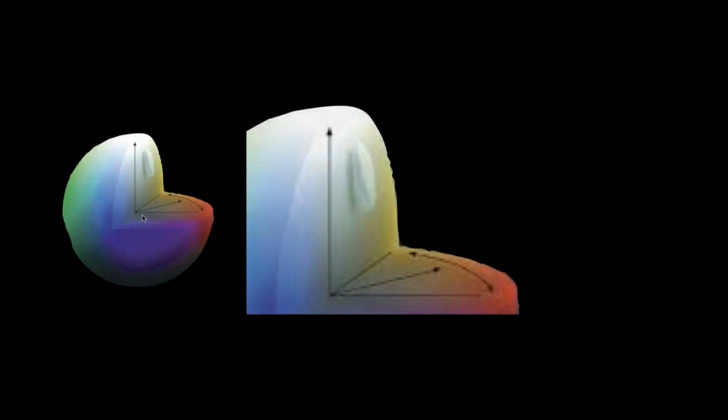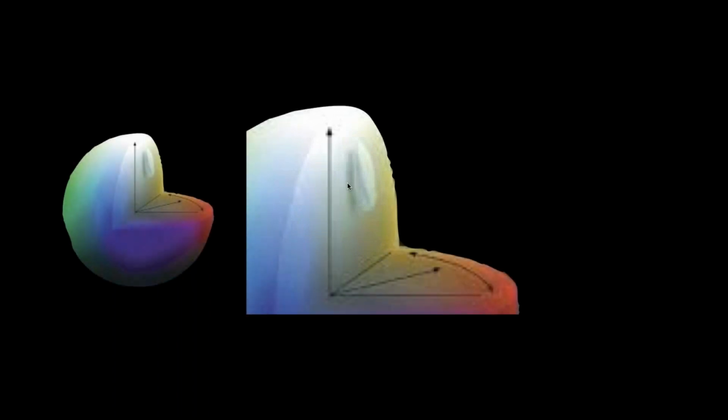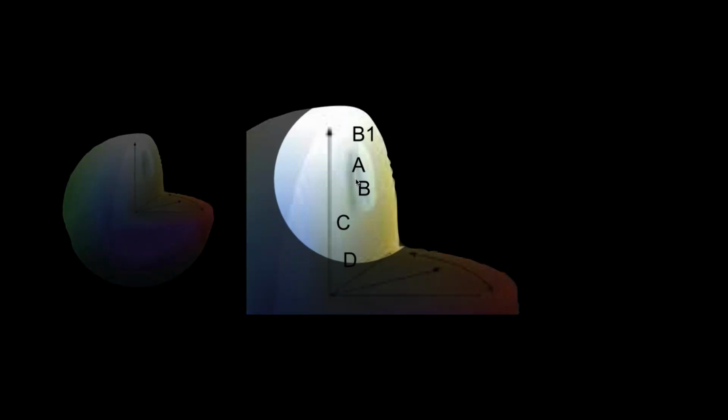When we talk about color, we're talking about an entire world of color. And this whole globe that you see here on the left of your screen is all the colors that the color spectrum presents to us. And if we zoom in on that, that little area right here is only dental color. So this little area here is where you see what we call dental color. And what's interesting about that area is when you really look at shading, you're going to notice that the A and B shades fit in there fairly well for basic color.